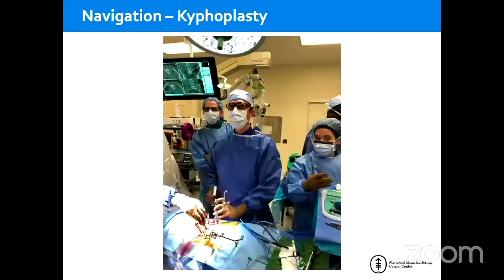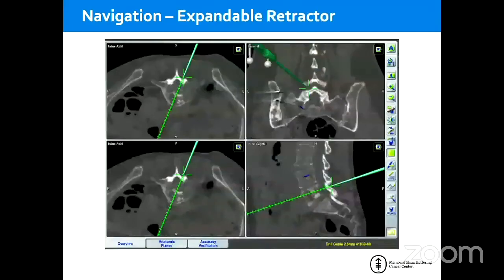And we use the integrated Jamshidi needle in the navigation system, and then the placement of the retractor for the decompression. A lot of the time, we don't have the luxury of having intact posterior elements and lamina, and so when you put the initial dilator, sometimes we have to be careful not to go into the spinal canal when there's lytic tumor in the lamina. So once again, having navigation, knowing exactly where we are with these dilators, is very helpful.